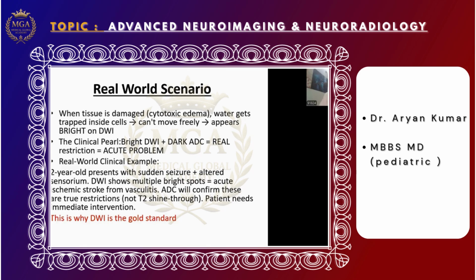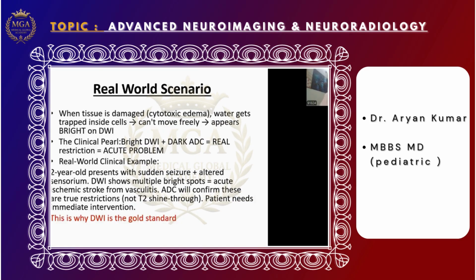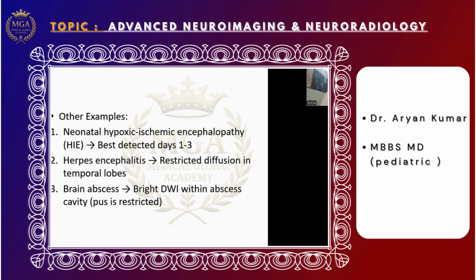Now the term ADC will come. Diffusion weighted imaging is the starting phase. Now, to support the diffusion weighted image, what is the term ADC? Is the diffusion weighted image true or false? This is supported by ADC. What is ADC? It is nothing but apparent diffusion coefficient. I will discuss that in detail here. First comes diffusion weighted imaging. Diffusion means what? Water molecule. I will go to the next slide.